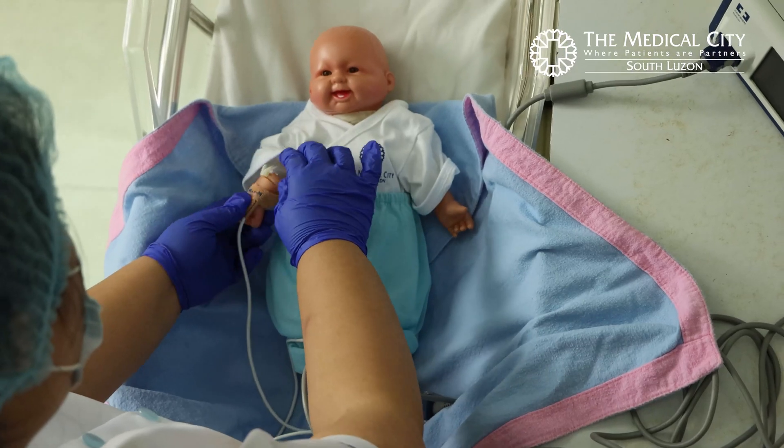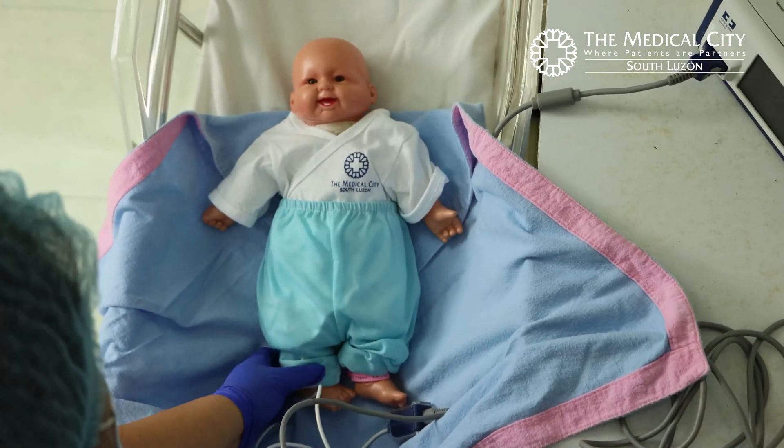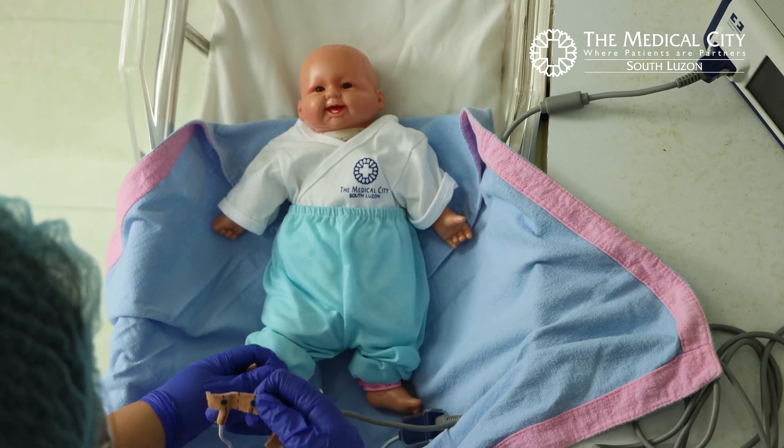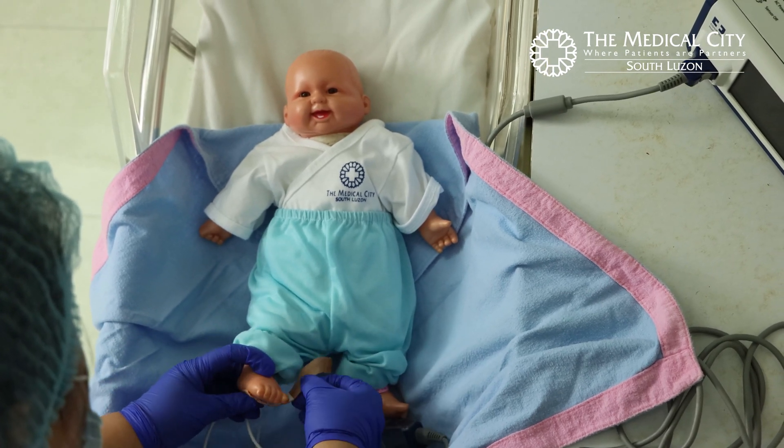Remove the probe from the hand. Ensure that the patient's foot is warm before you wrap the probe around the foot. You may use either foot.